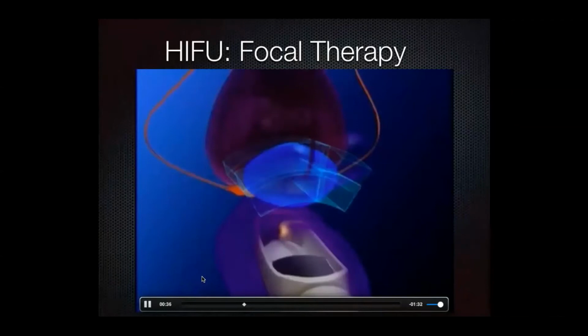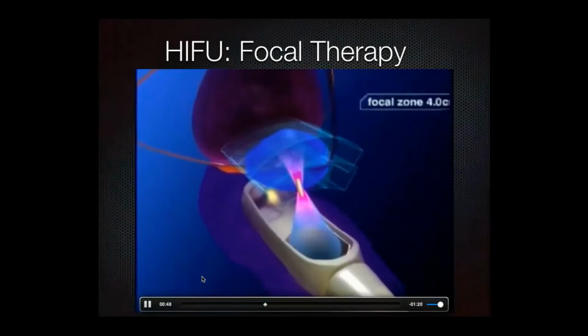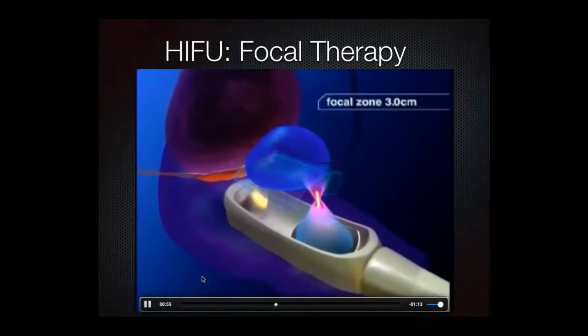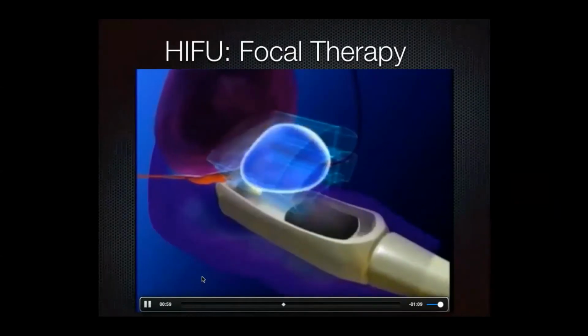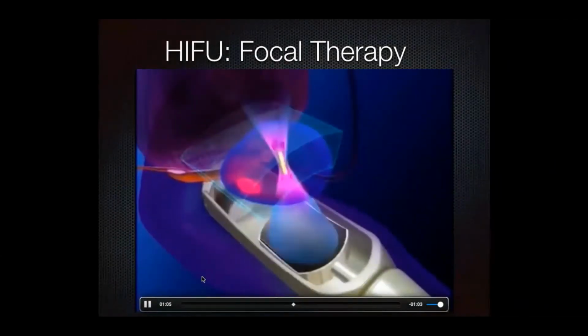Similar to what happens when sunlight is focused through a magnifying lens, precise focusing of ultrasound energy during HIFU treatment elevates the temperature of the tissue in the focal zone very rapidly, while intervening tissue between the transducer and the focal zone is kept at a safe temperature. The result is an accurate and repeatable lesion at the target sites that are monitored in real time by the treating physician. All the treatment zones are pre-planned and checked by the physician prior to starting the HIFU treatment.